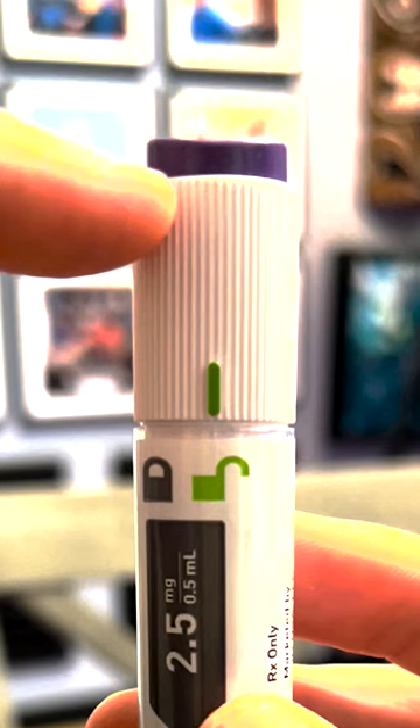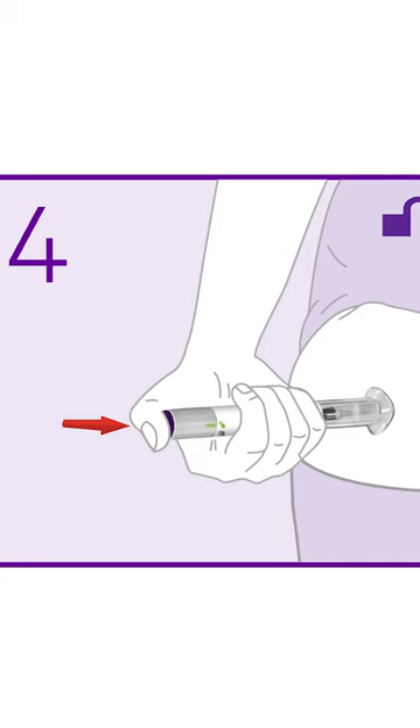When you first push the purple button, you'll hear a click — that's the needle administering the dose. When you hear the second click, that means the needle is retracted and the injection is complete.